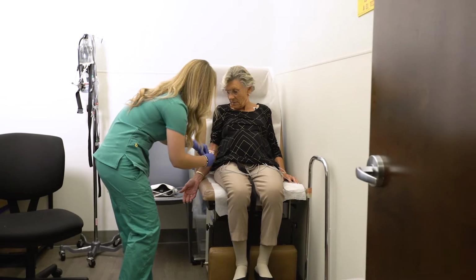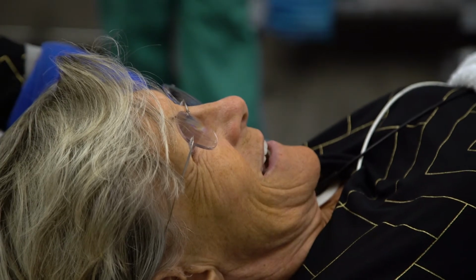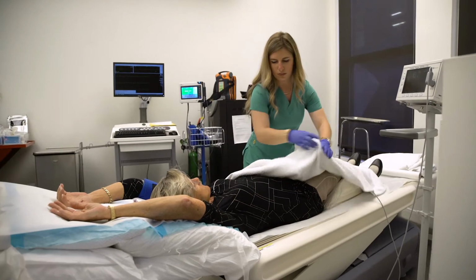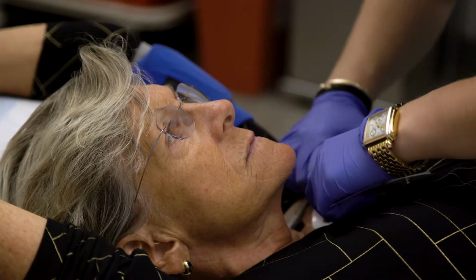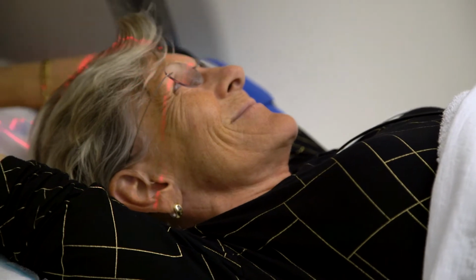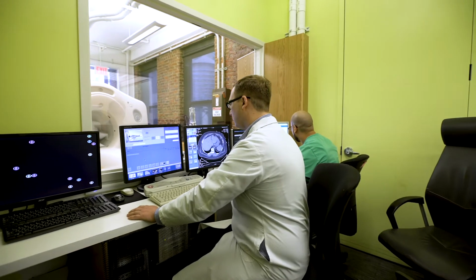I think raising the level of awareness of where your heart health is at the moment is the important factor here. PET scans can be used for many different applications, including post-surgical scan to see if a bypass or stent is working, pre-surgical scan to determine the extent of heart blockage, determining the need for a coronary angiogram, determining the need for a coronary stent or bypass surgery, determining whether your heart can handle physical activity, and can provide a post-heart attack or heart trauma snapshot.